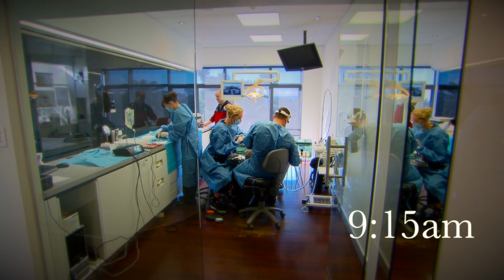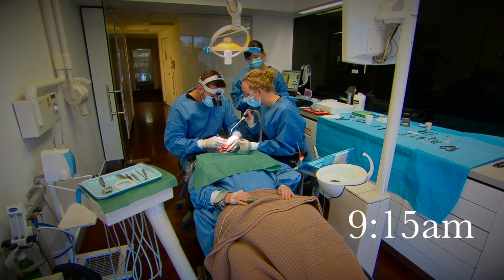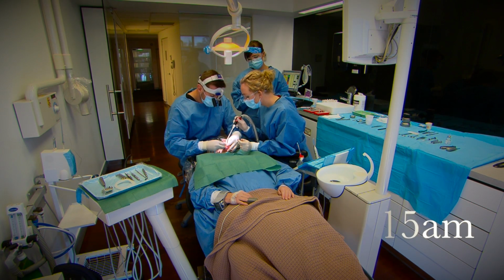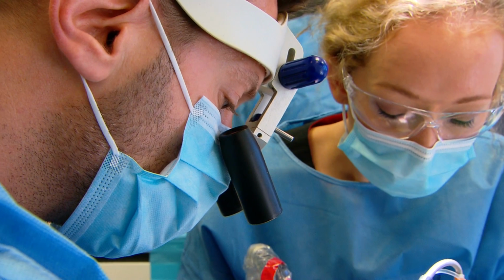The first stage is to remove the remaining teeth. These teeth have been removed, and it's by far and away the most traumatic part of the procedure. We have to use a lot of force. The actual implant part of the procedure is very gentle and very precise.